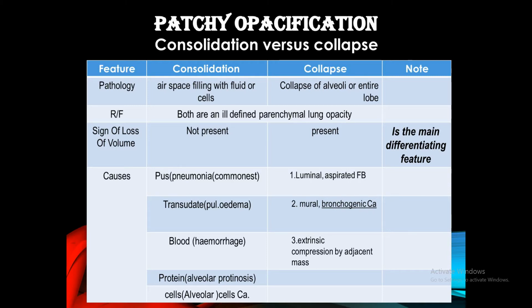أهم نقطة في التفريق بين الكولابس والconsolidation هي signs of loss of volume. If signs of loss of volume are present, this means that we are dealing with collapse. If the signs of loss of volume are absent, this means that this is consolidation.